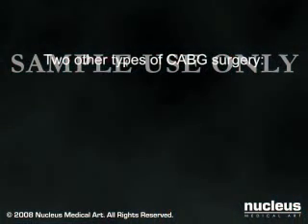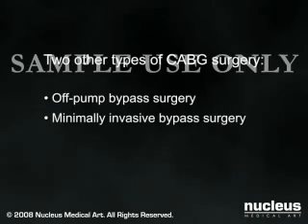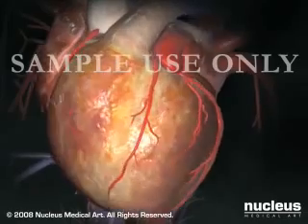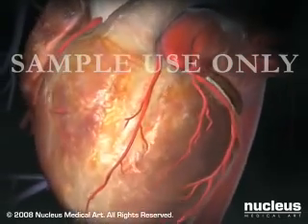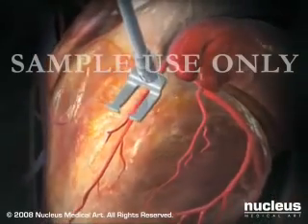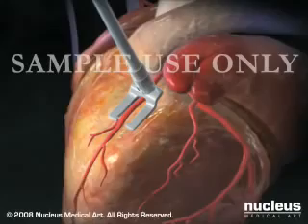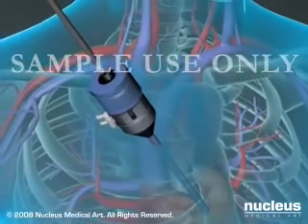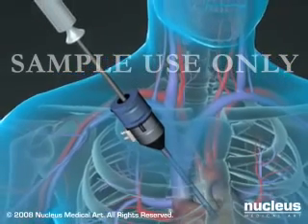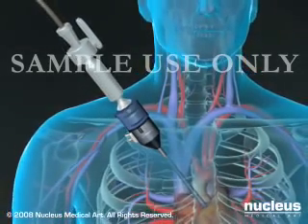2 other types of CABG procedures have recently been developed: off-pump and minimally invasive bypass surgery. Off-pump CABG is also called beating heart bypass grafting because the heart isn't stopped and a heart-lung machine isn't used. Instead, a mechanical device is used to steady the part of the heart where grafting is being done. Surgeons perform minimally invasive bypass procedures using specially designed instruments inserted through small incisions or ports in the chest. These procedures sometimes require a heart-lung machine.